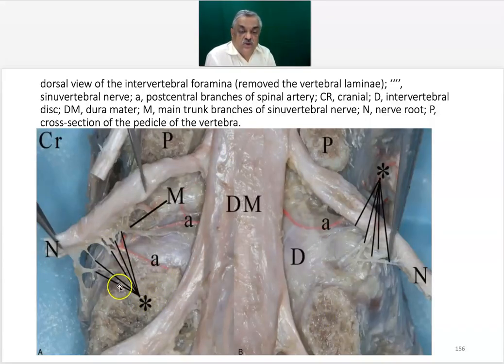Now these are also lower pedicles. This is actually the disc. Anything below this lower margin of the disc, down here, is the lower zone or the lateral recess. This is the middle zone or the disc zone. And everything above this superior end plate of this disc level is the upper zone. So this is the upper zone.